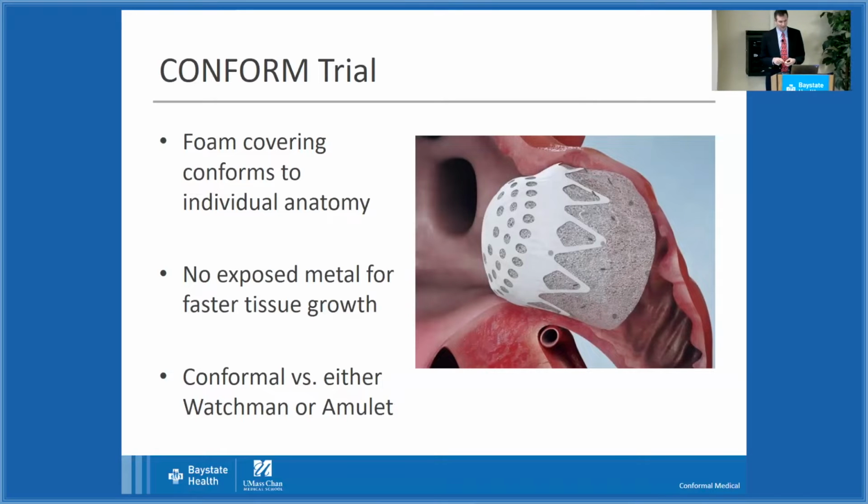It's also worth saying that there's no exposed metal here, and so the thought is that tissue will grow over it even faster. So you may not need the antiplatelet agents for a full 6 months. Okay, so that's left atrial appendage occlusion in a nutshell.